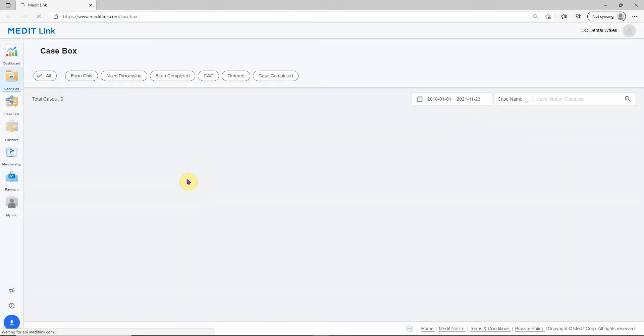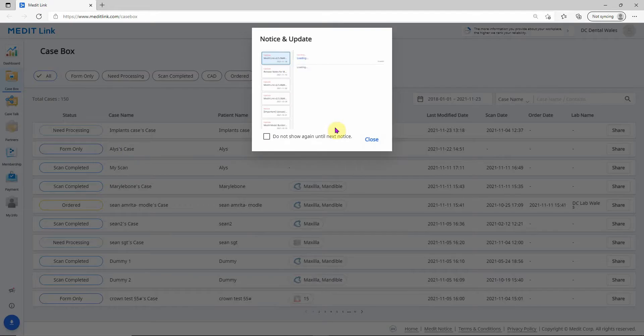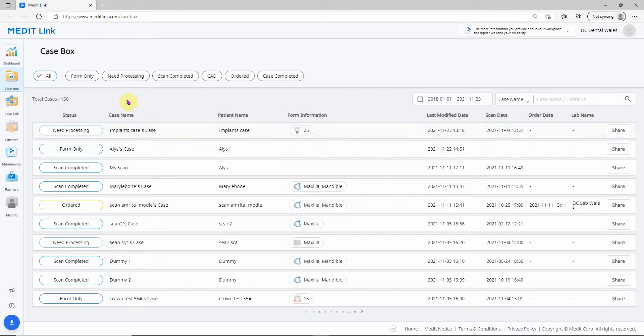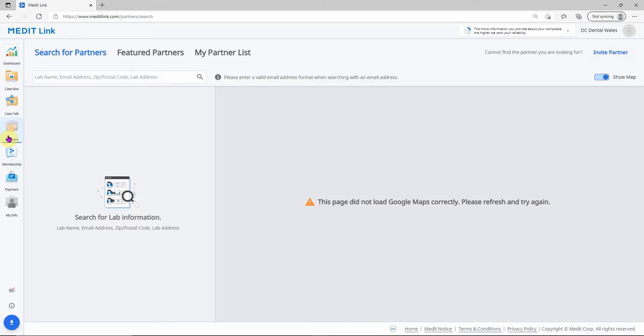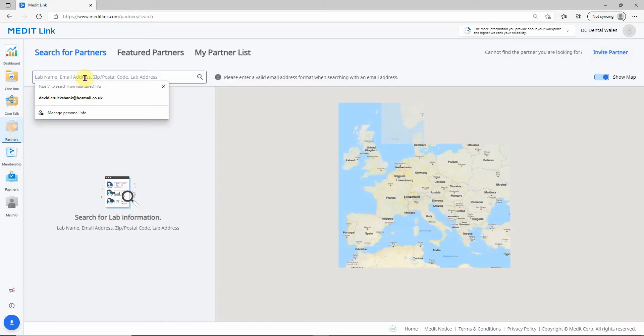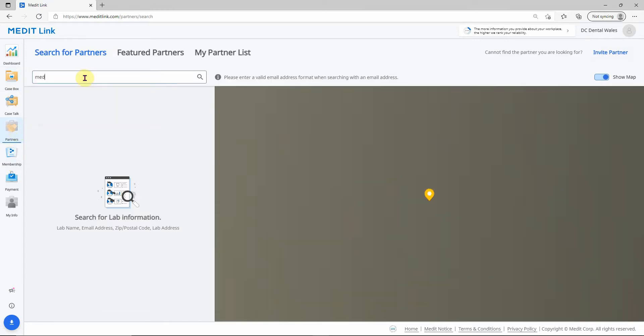This will be a mirror of your case box. So there's your cases. On the left-hand side, there's a tab called Partners. If we click on Partners, we can then search here for everyone.